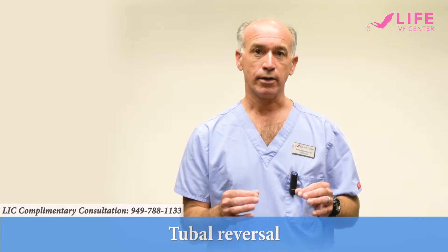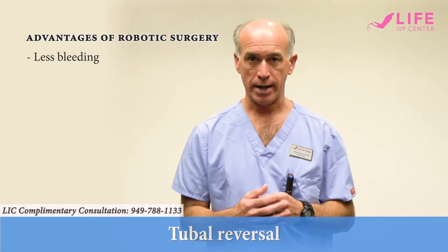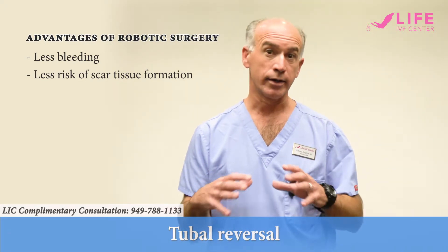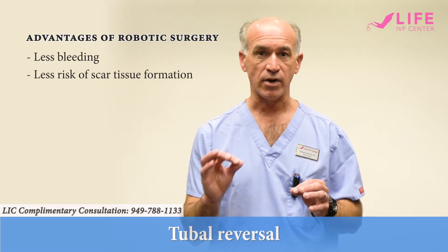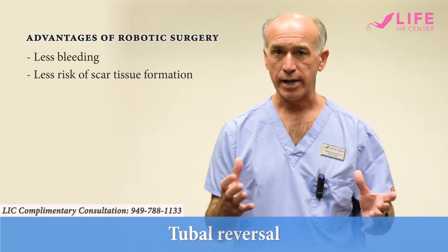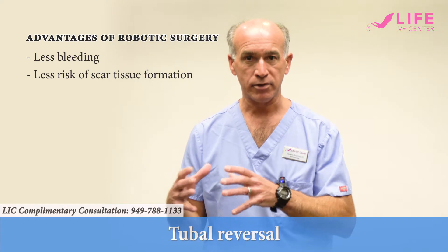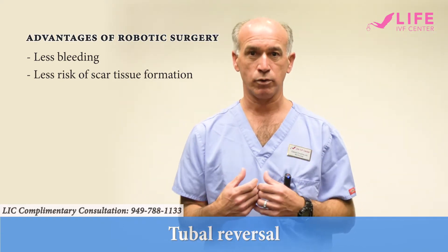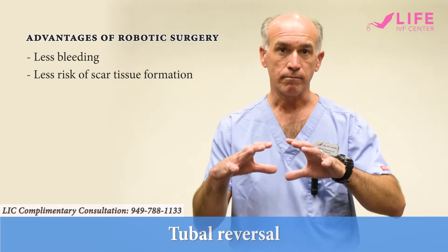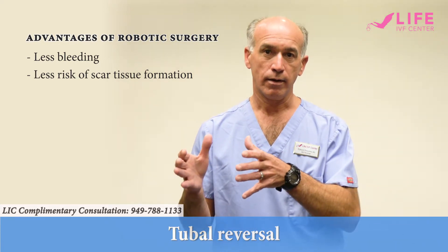The other advantage of doing the reanastomosis robotically is that there's more precise hemostasis. Patients have less bleeding because you're not cutting into the abdomen. Patients also have less risk of scar tissue formation because you're operating in a closed humidified environment. You're still using the same fine suture material, but with the robotic platform we have high definition 1080p visualization that's magnified. So instead of using a bedside surgical microscope, it's provided to us with the robotic platform with a 3D high definition magnified image — we can actually do the surgery in half the time with better outcomes.